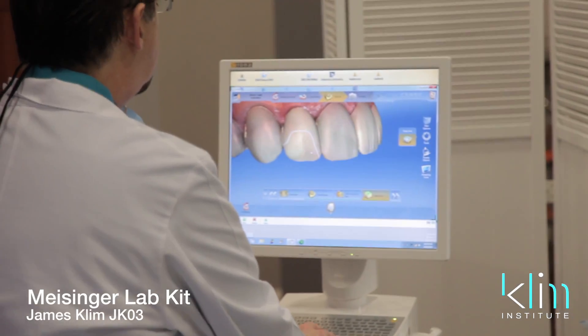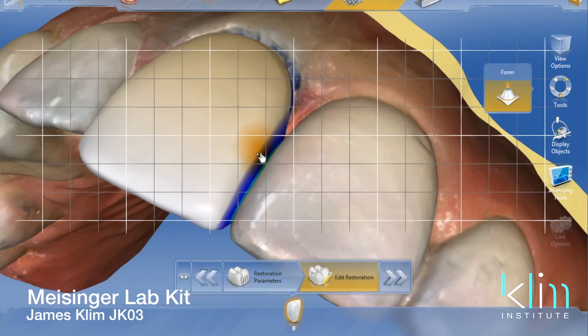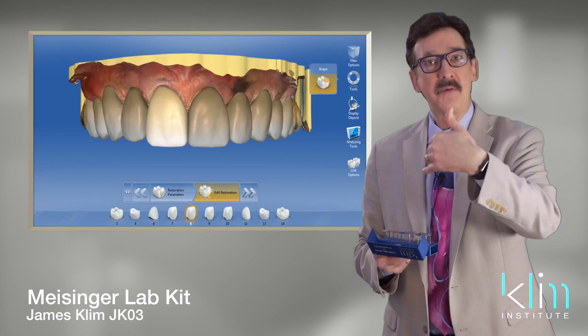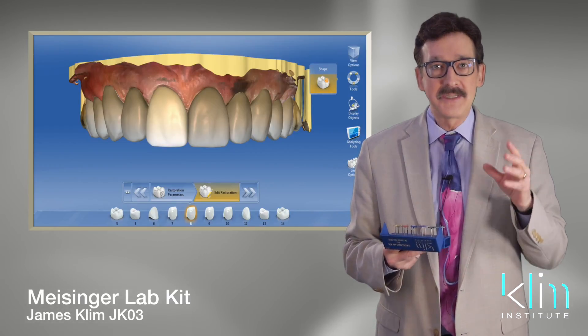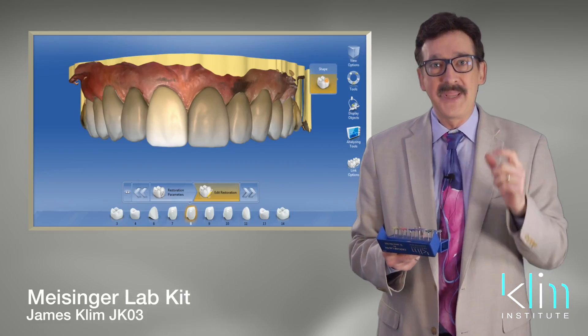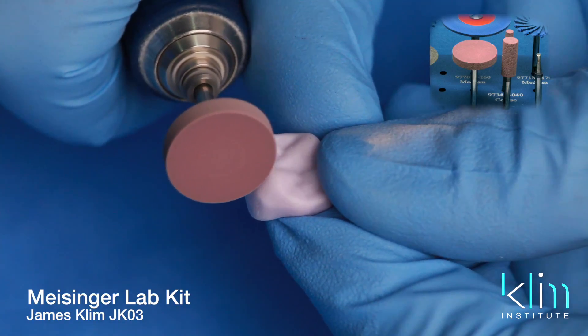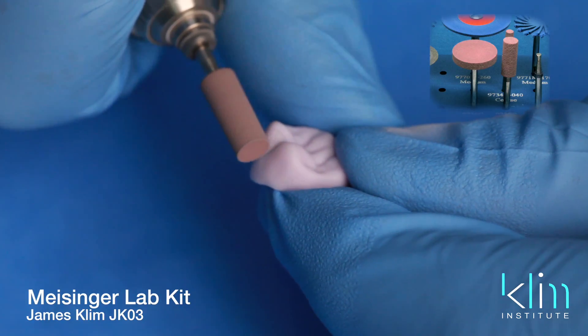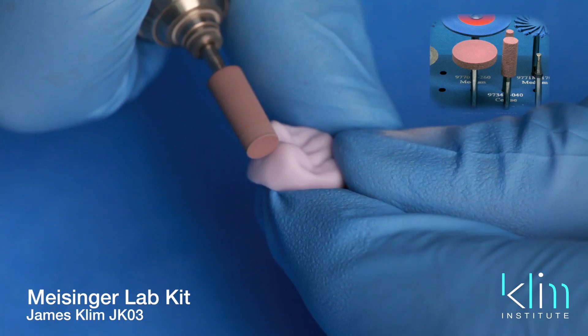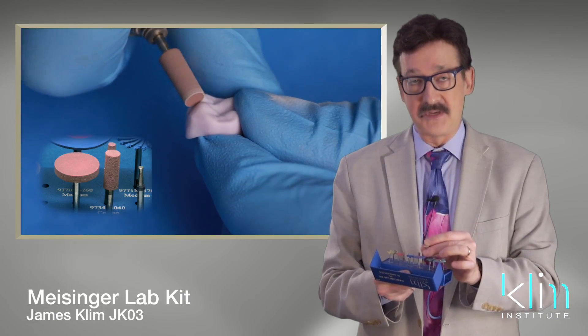Number one is we have to do our general shaping first — whatever is needed. Hopefully with most of our CAD softwares today, we can get most of our shapes down into digital design. Once it's out of the milling unit, we have to go through a few steps just to get the job done, and we want to make it very proficient so we can get a lot done with one burr. These pink diamond shapers are designed to not overheat your ceramic, and yet with some firm pressure, you can rapidly shape your ceramic without damaging it.